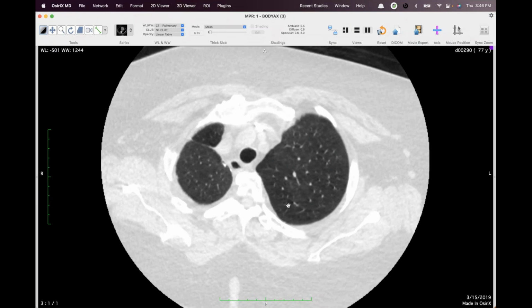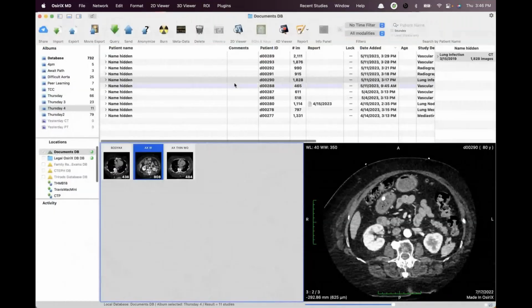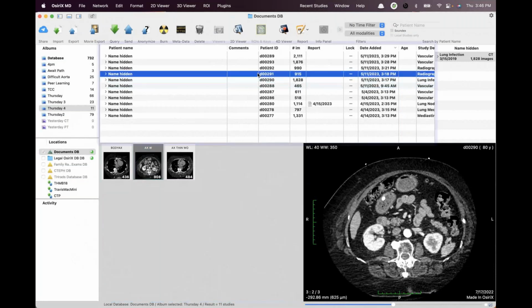Very nice. There are a couple of case reports, but I've never seen anything obstructed like that. All right, David, this one's for you.